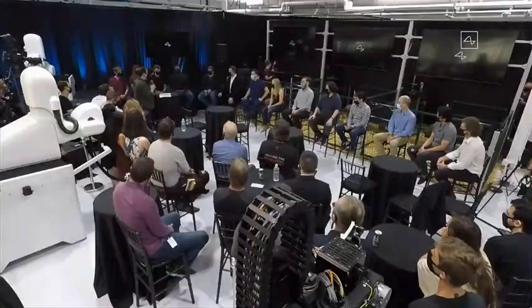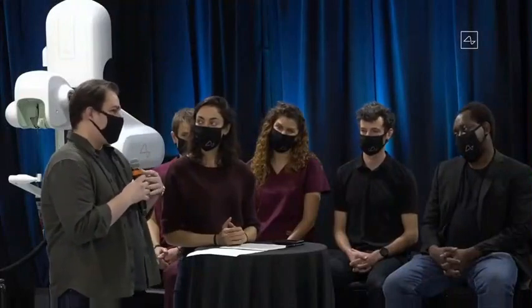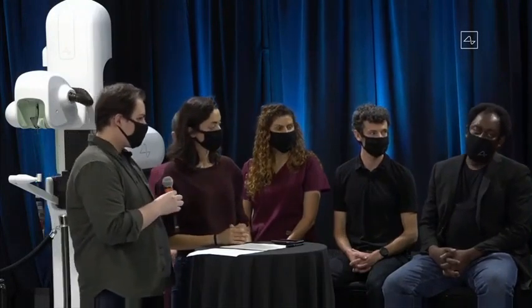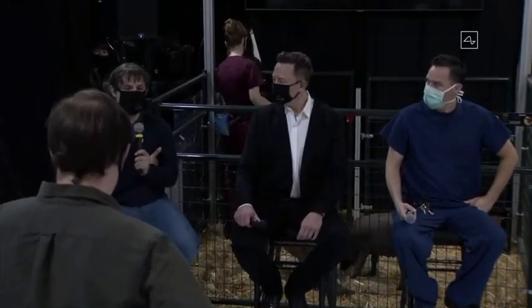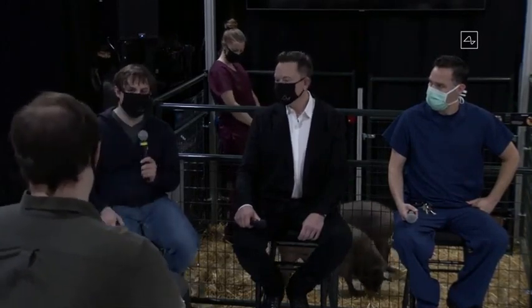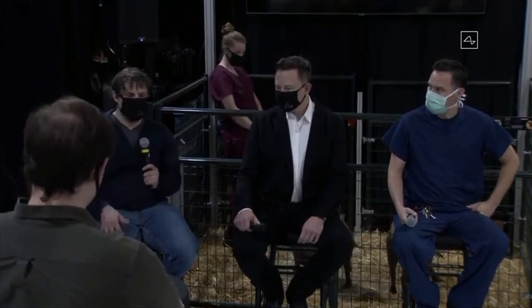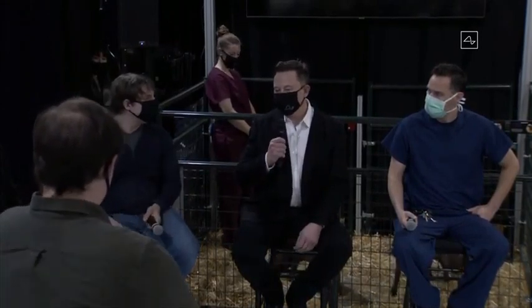Actually, Max, this might be a question for you. Some of the questions we had on Twitter was, how do you see the Neuralink device and the essentially API growing over time and allowing developers to interact with the device? So there's interesting questions long-term about whether you do decoding on head or on a phone or on a computer. Ultimately, at 1,000 channels, it's possible to send all the spike data to a phone and do processing there. As this gets bigger and bigger, you're going to be more constrained by the radio, so you're going to want to push more of this on head, and that changes your programming model. But really, the APIs you're getting either bin spikes, or you're getting raw waveforms, and you can consume it basically like an audio feed. Yeah, it's worth noting, the lossless compression of the data stream is about 100 kilobits with 1,024 channels.